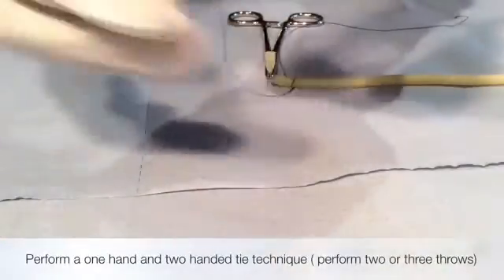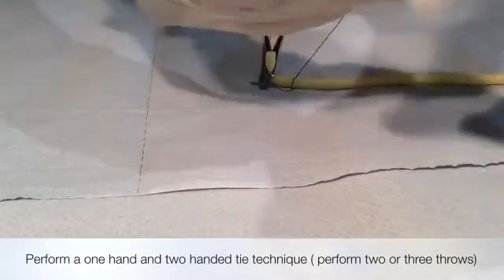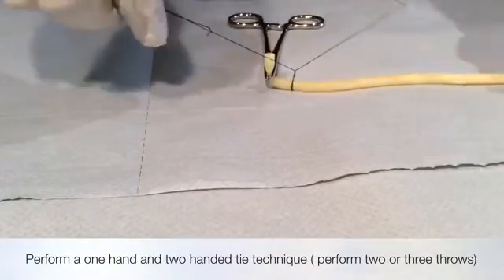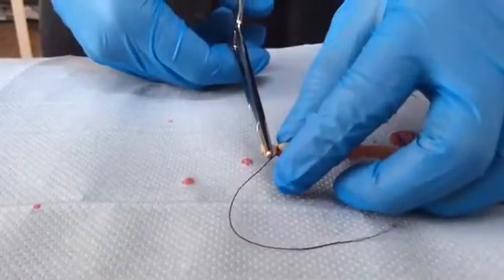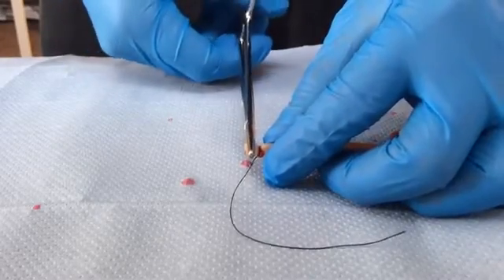Then you will have to perform either a one or two-handed tie technique. You should aim to do two or three throws to secure the knot. Once you have secured the knot, release the haemostat to see whether you have controlled the haemorrhage.